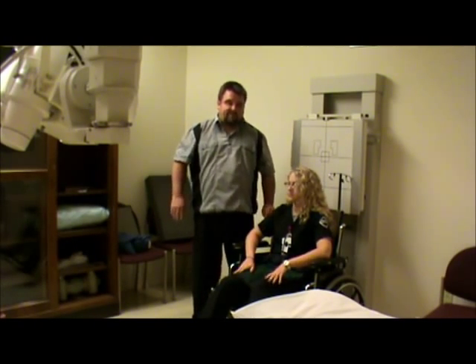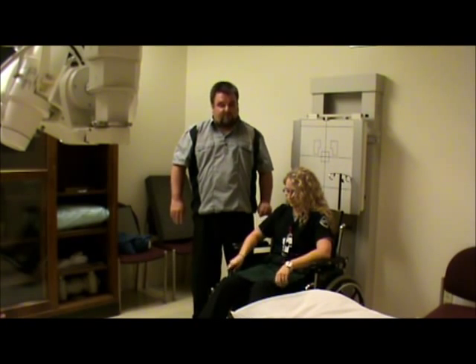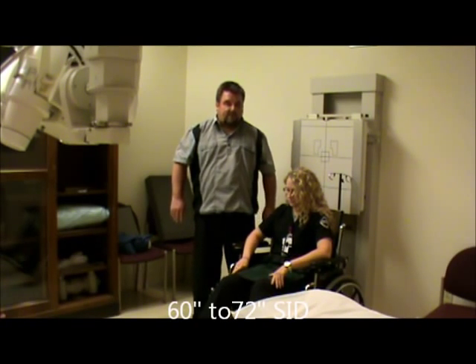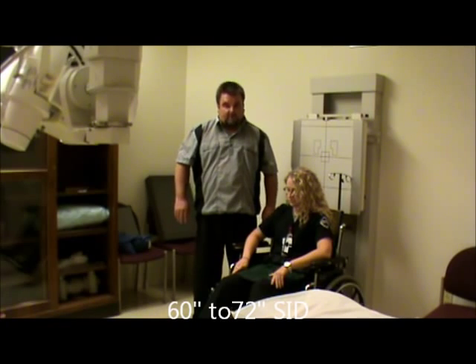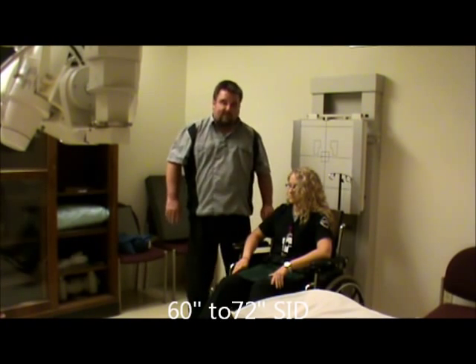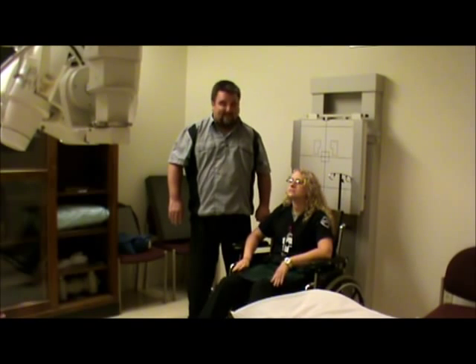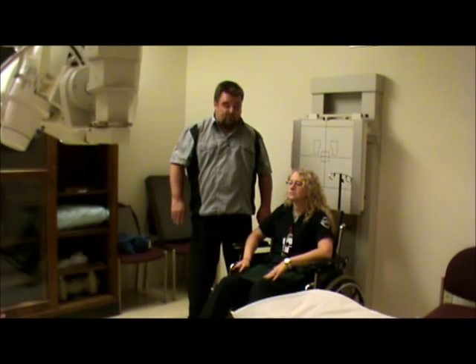Our SID will be 72 inches. The reason for a 72-inch SID is we're trying to reduce the magnification of the heart and lungs as much as we possibly can. The technical factors for the AP view will be 96 kV at 2 mAs — that's just an average.